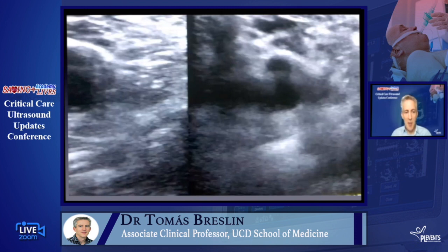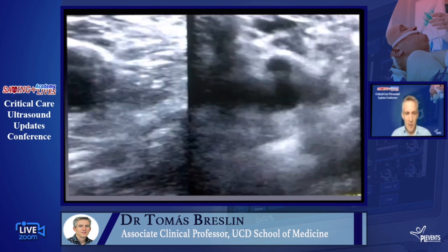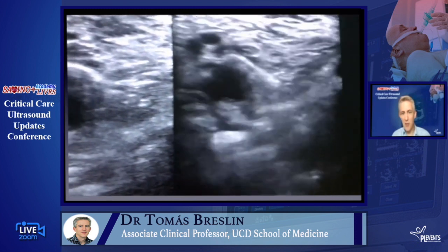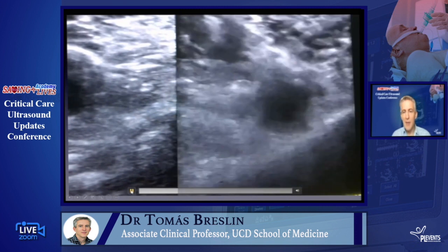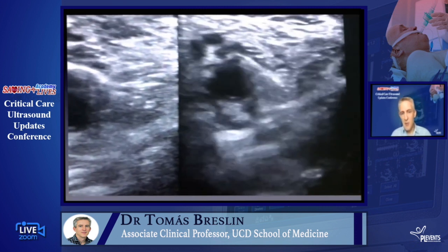And then this is the popliteal vein being compressed. The popliteal vein is on top of the artery, or it's closer to the probe. So pop on top, we use that if you're looking for the popliteal vein. It's easy to compress. So very often when you can't find it, you're actually compressing it. So pop on top, if you remember that for popliteal vein. So that's a nice popliteal vein. It's a small one, but it's compressing fully.